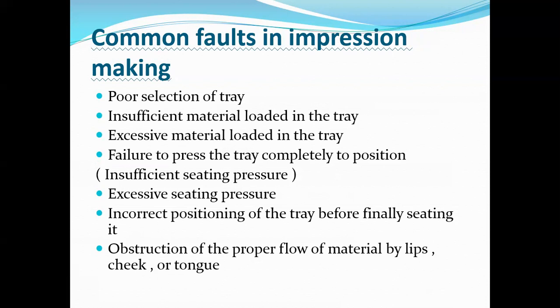The common faults in impression making. First, poor selection of tray.